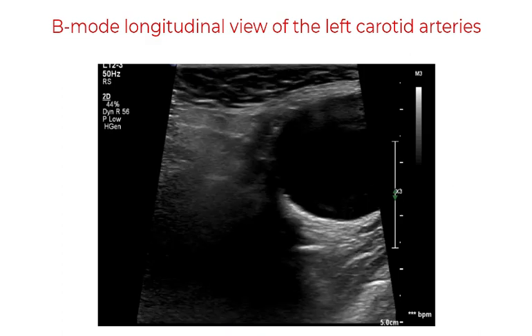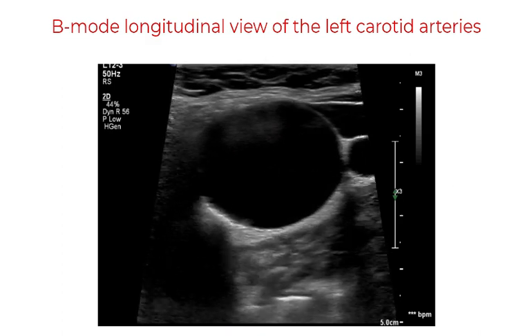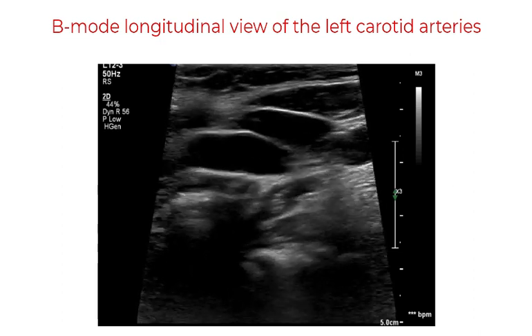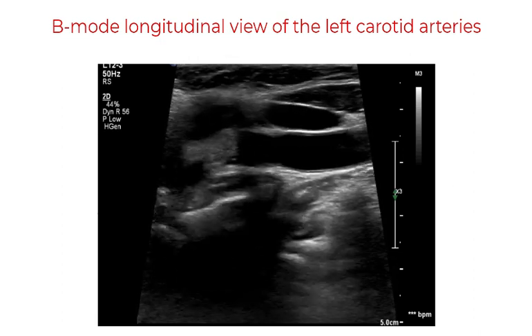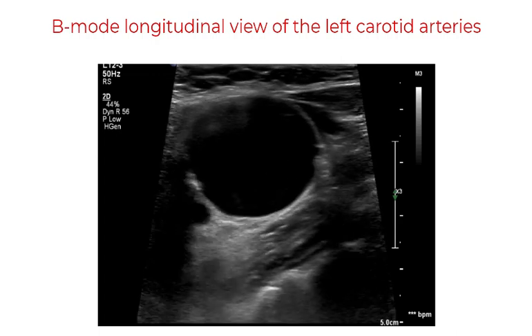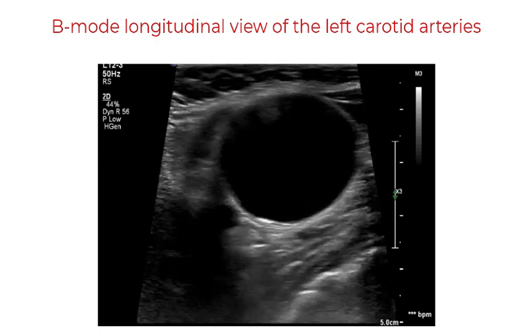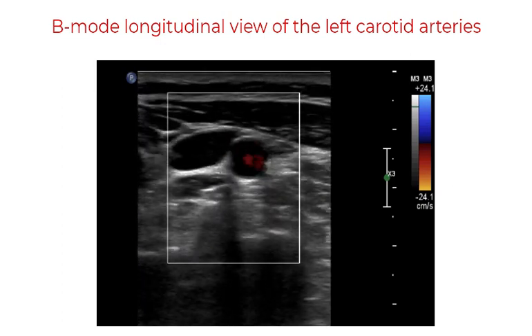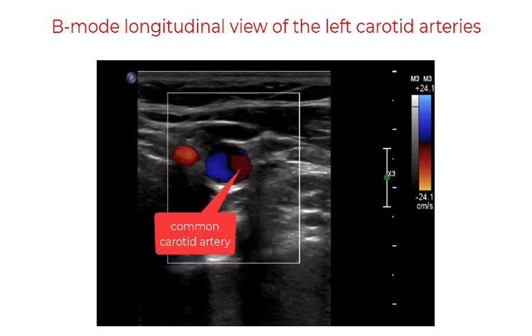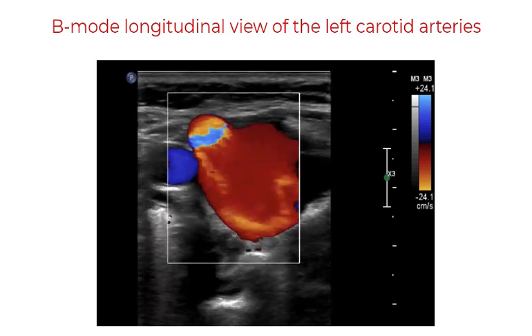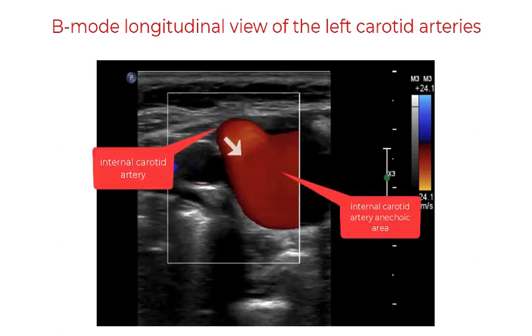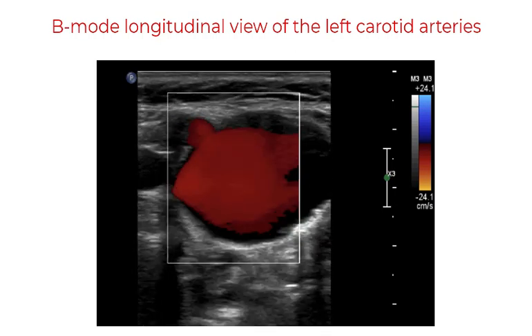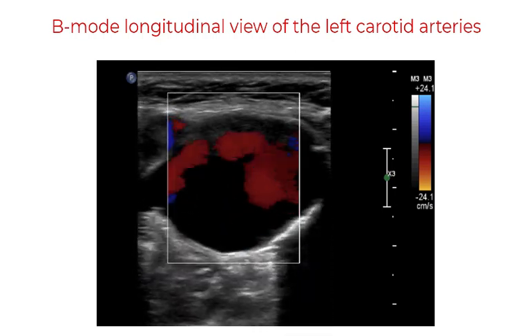We can note that this area is anechoic, which suggests the presence of fluid, and at this end we can see the internal carotid artery. The internal carotid artery appears to open into this anechoic region. By applying color flow Doppler, we can then determine whether flow is contained within this region. We can see that indeed there is color flow which appears to come from the internal carotid artery, due to the presence of a jet where the internal carotid artery is present.